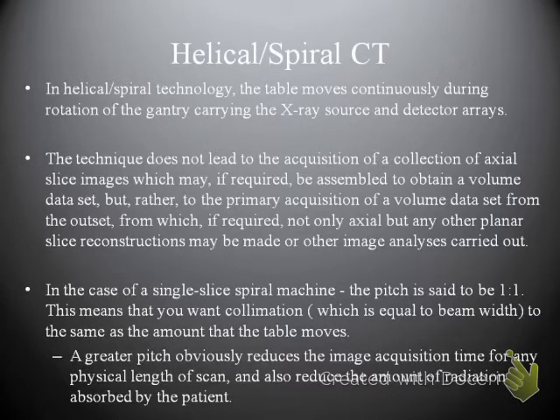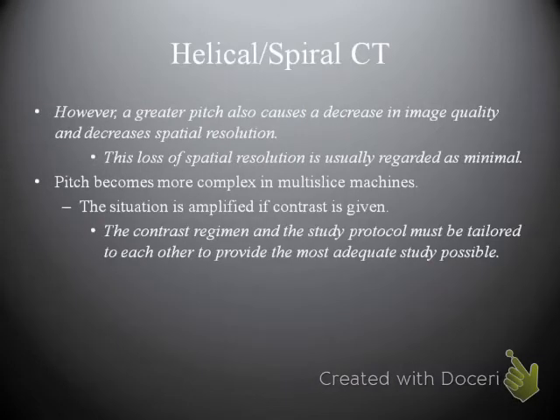And so, as we see here, greater pitch means that you can acquire the images faster because the table is moving more, and that you don't give the patient as much dosage. So that should make a little bit of sense. However, a greater pitch also causes a decrease in the image quality and decreases spatial resolution.